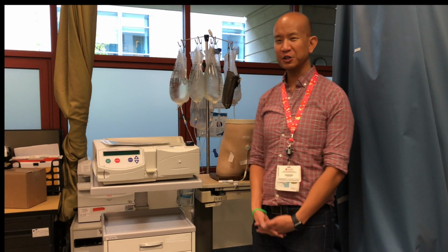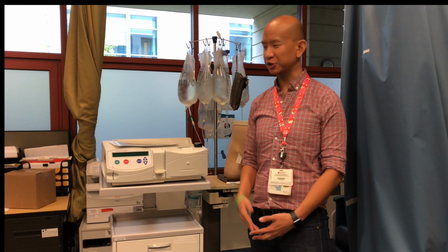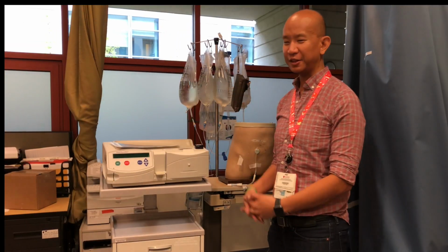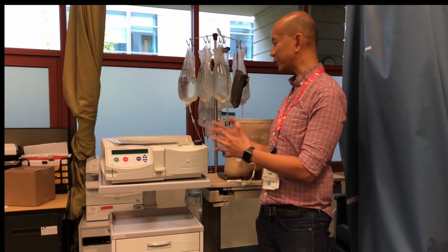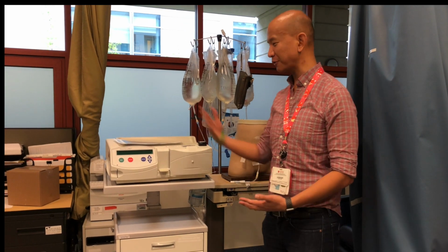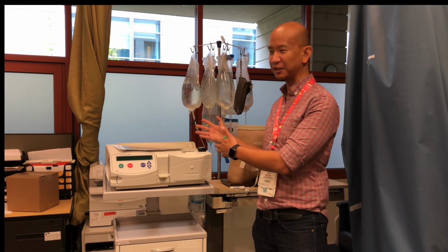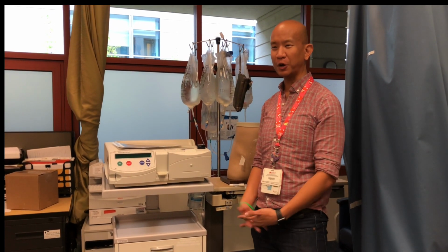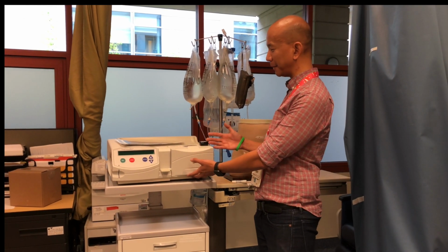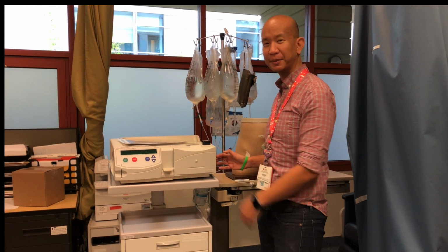So the setup for peritoneal dialysis typically takes somewhere around 20 to 30 minutes for the cycler machine to get set up and for the peritoneal dialysis solution to be primed through the tubing that will connect to the patient. So after turning on the cycler, the dialysis solution is put onto the cycler to warm up the solution before it goes into the patient. And a set of replaceable tubing is placed into the dialysis machine setup.